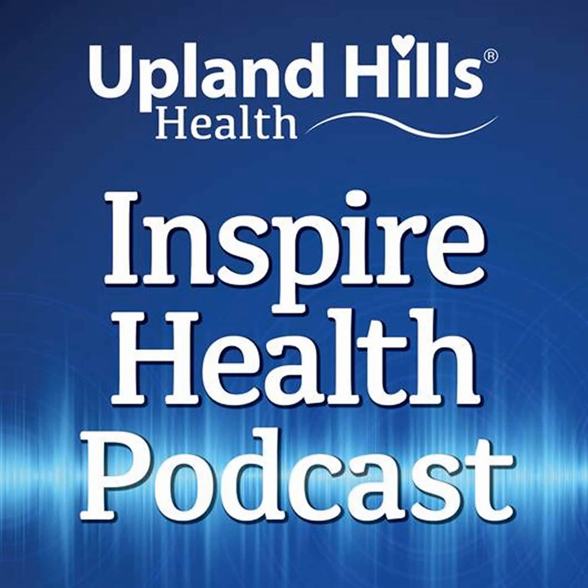The other thing about getting used to the CPAP itself is making sure you have been fitted and have the right mask. If you ever at any point get CPAP and you find out, I hate this mask, I do not like this, then you need to get a different mask. The biggest part about being compliant and being able to be comfortable and wear CPAP is liking the mask, having the right mask. That is a huge, huge thing. So you need to be proactive about your mask and how you like it.